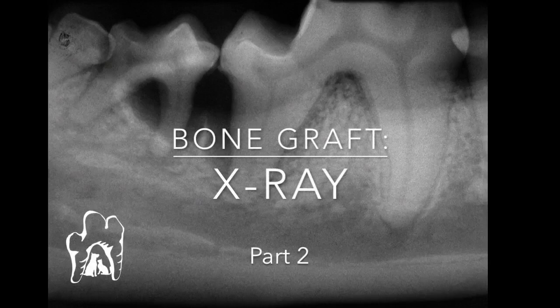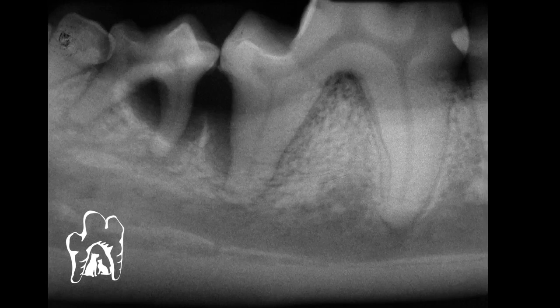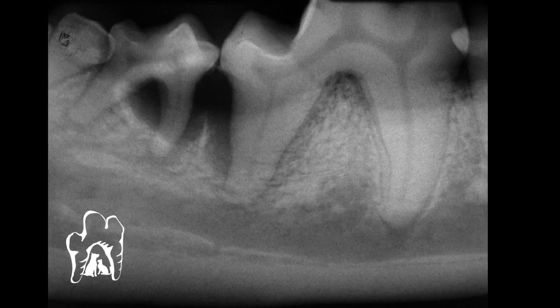Looking at that radiographically, you've got that defect back there adjacent to the distal aspect of the distal root on that first molar, which is a significant area. You've also certainly got the bone changes on that second molar. The second molar is dispensable, so we would definitely want to extract that because that's part of the reason why that defect's there, and it's not a highly functional tooth.